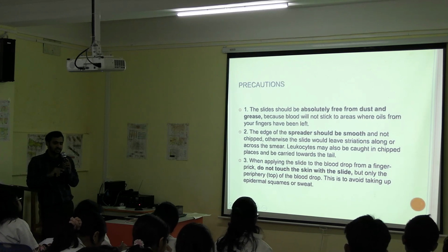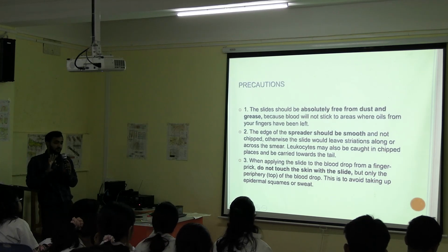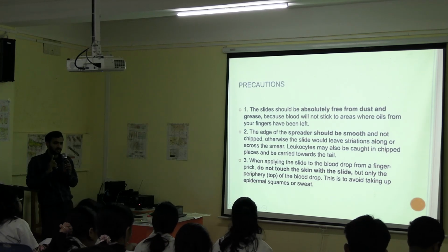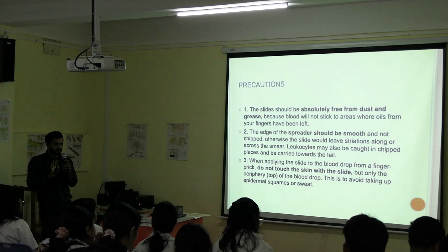Okay, the spreader: you will be using the width of the spreader, not the length. Here there are 4 edges. So with one spreader you can prepare at least 4 smears, so you'll be using that.